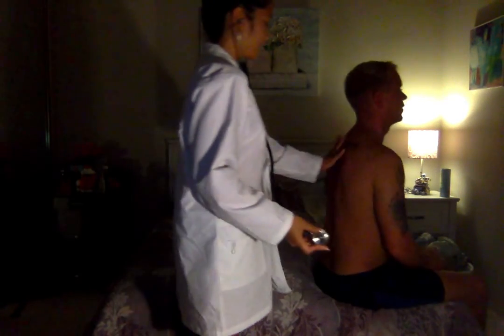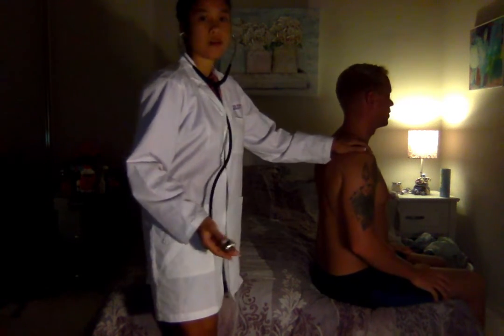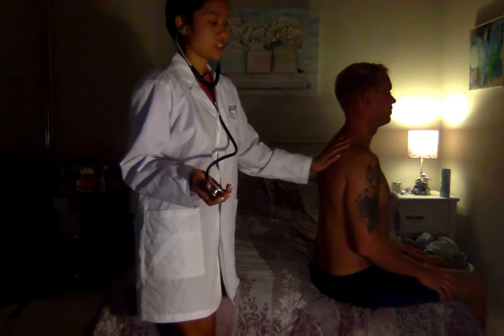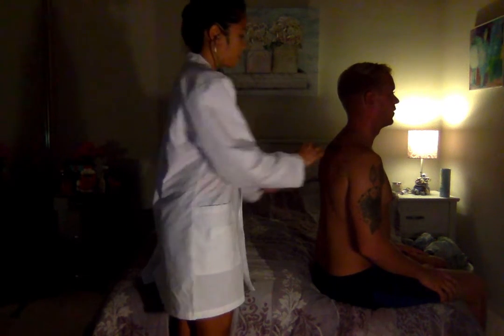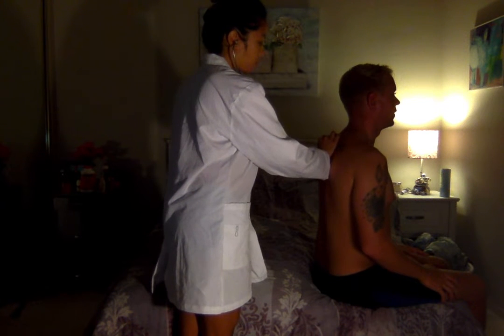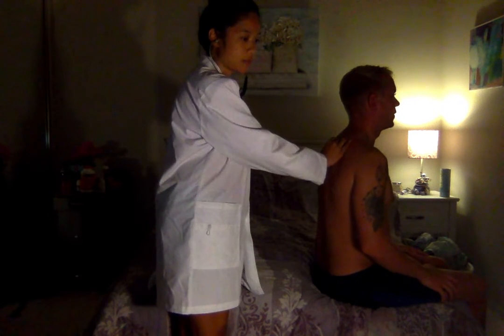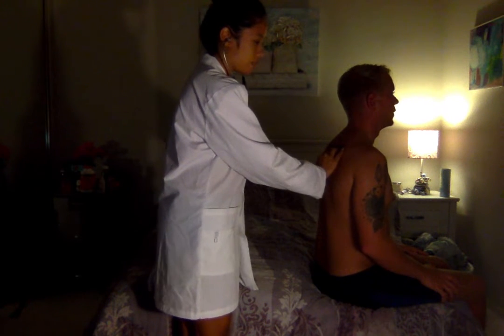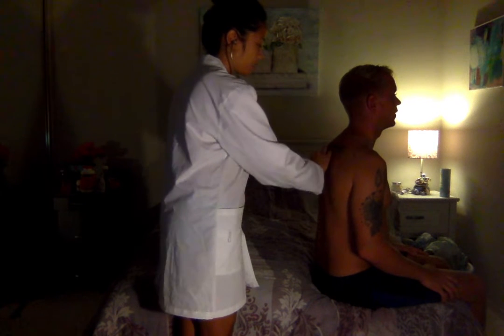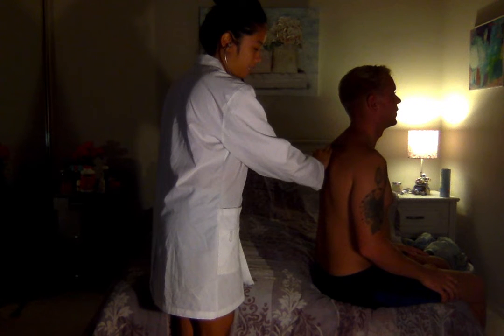So I'm going to be checking his posterior aspect, going in a ladder fashion as well. When I checked the anterior, I also made sure that I checked for the apex of the lung, which is at the sternal end of the first rib. So now I'm going to do the posterior, going in a ladder fashion. Take a deep breath. Making sure I check for any adventitious sounds, checking for breath sounds as well, that it's not diminished or increased in any of the lung areas. Good. So far all lung sounds are clear to auscultate bilaterally.